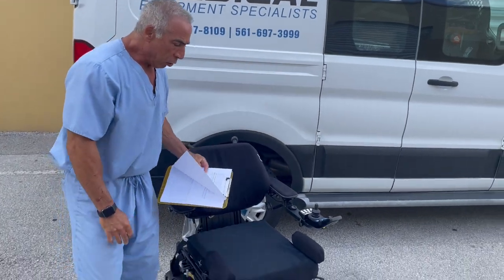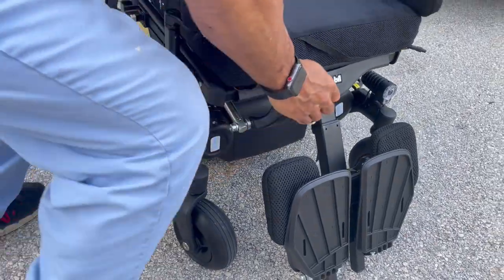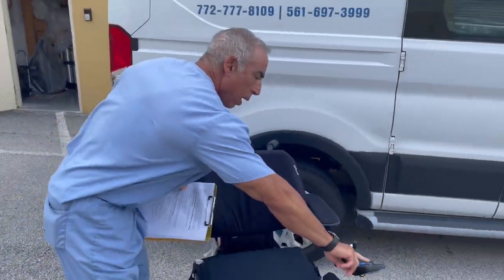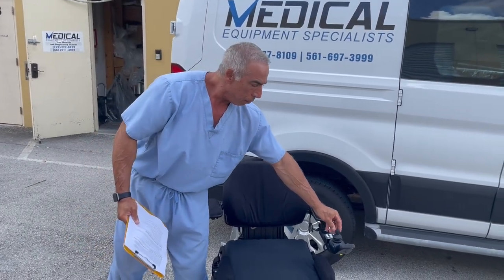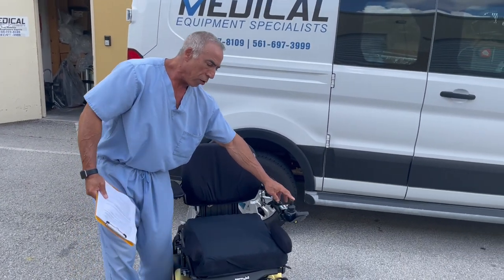To put the chair back in drive, we do the opposite. We turn the motor to the outside, turn the motor to the outside, and we power up. Now the chair will drive.